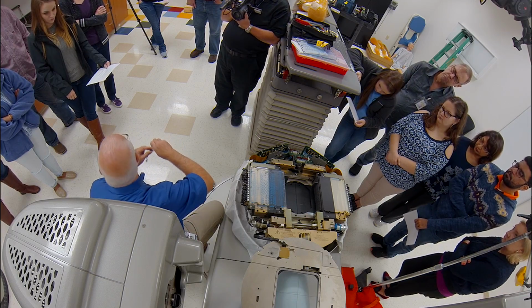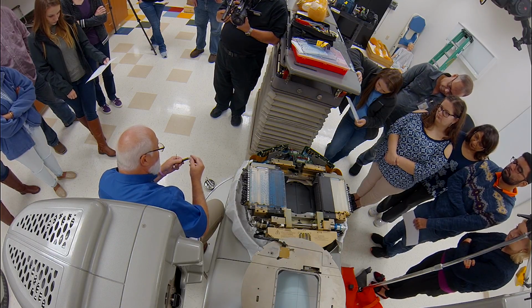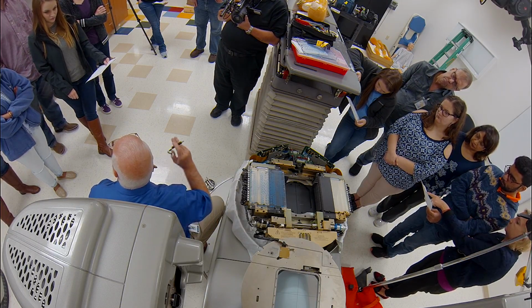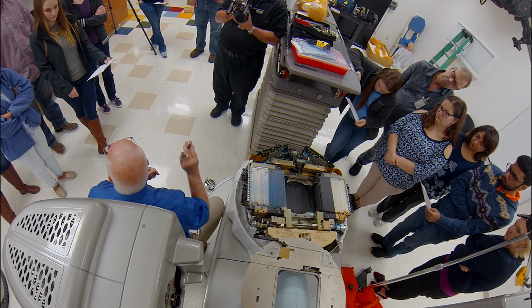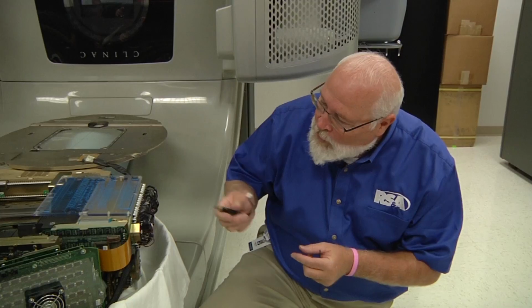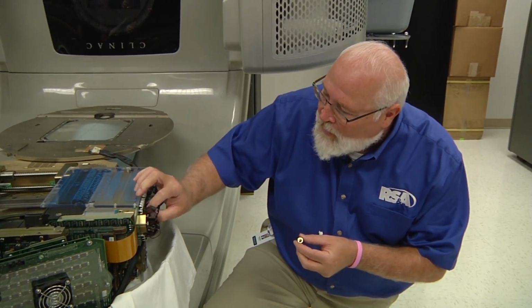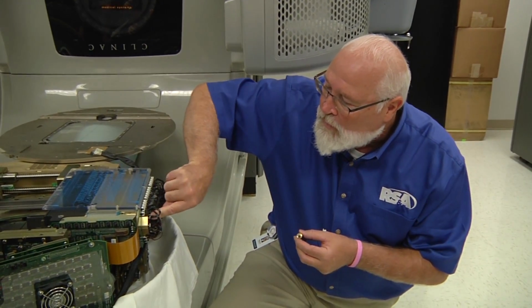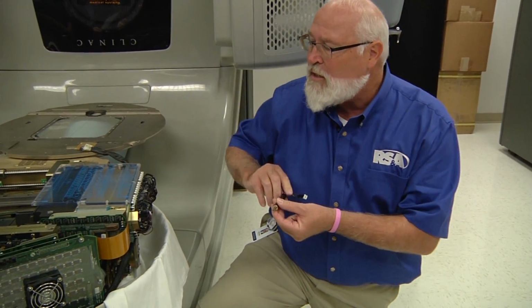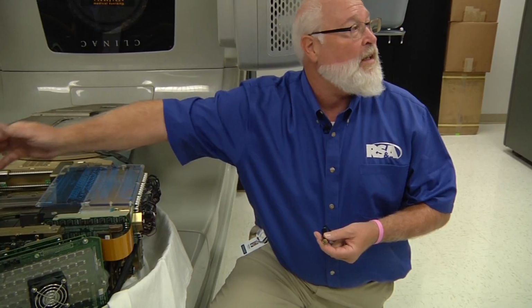So here's the coupler. If that coupler doesn't fit in the groove, it won't be springy. It'll be stiff. So you always want to make sure you stick that in there, and you can take this and turn the motor by itself, and you'll see your leaf move in and out.